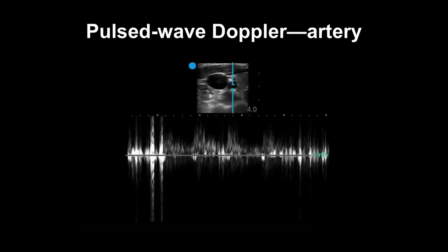Here you can see an example of pulse wave Doppler in an artery. You can see these high velocity spikes. These correlate with the pulse.